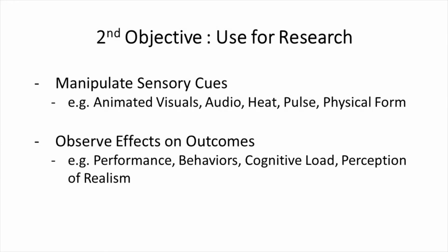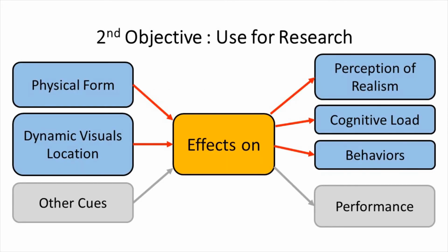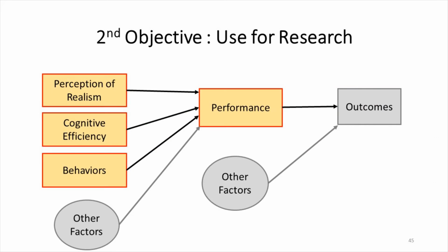After development of the physical virtual patient bed, my objective is to use it for research. I am interested in manipulating different sensory cues, for example, the location of dynamic visuals and physical form. I am interested in observing the effects on outcomes such as behaviors, performance, cognitive load, and perception of healthcare providers.